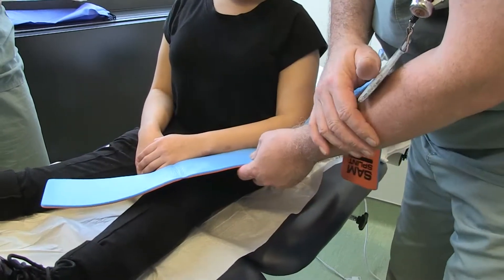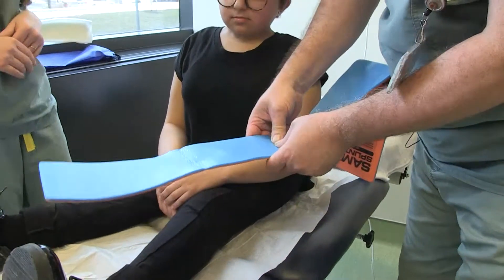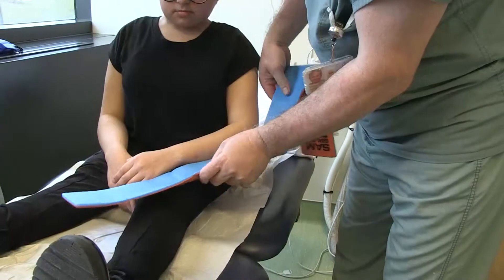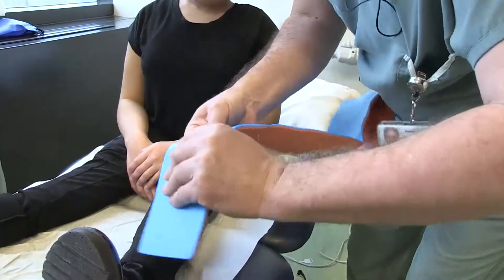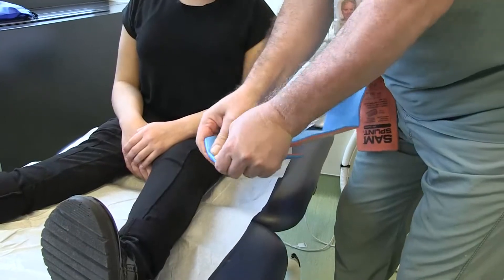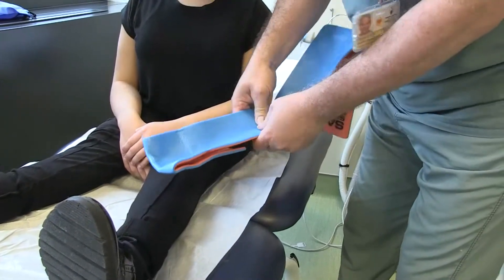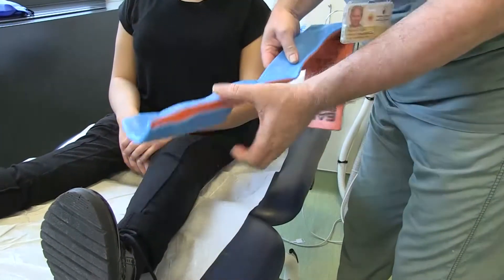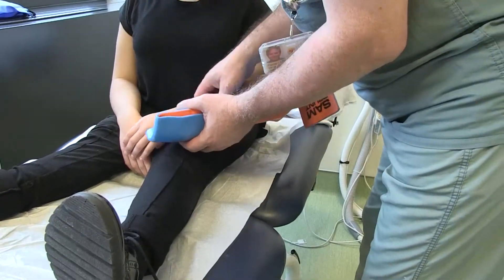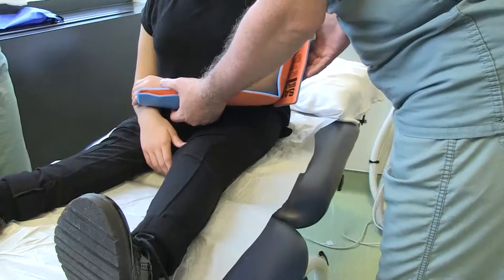We eyeball it, so at this point we could fold it and give it the same shape as the other section. Here we go, so now we can insert it. You position your arm slowly.